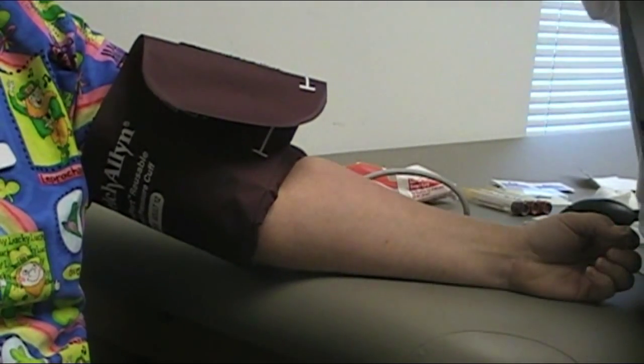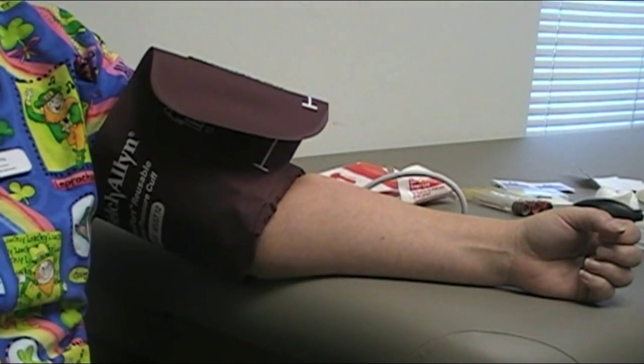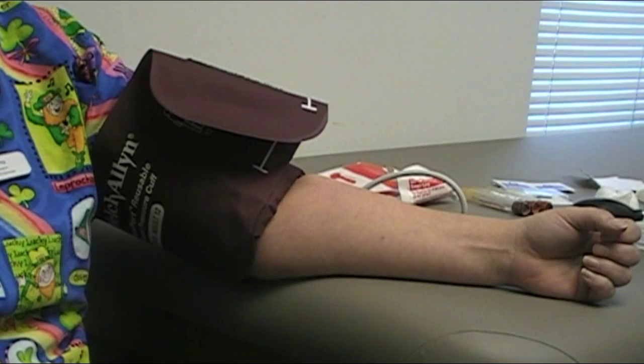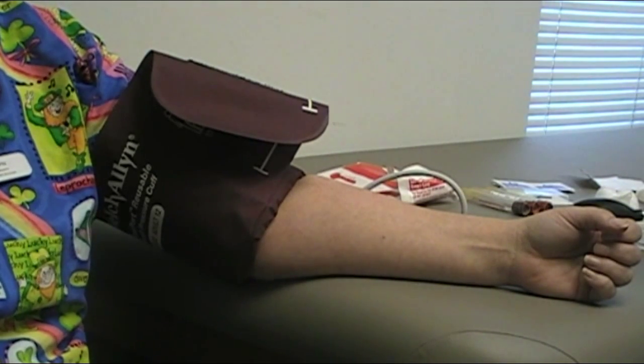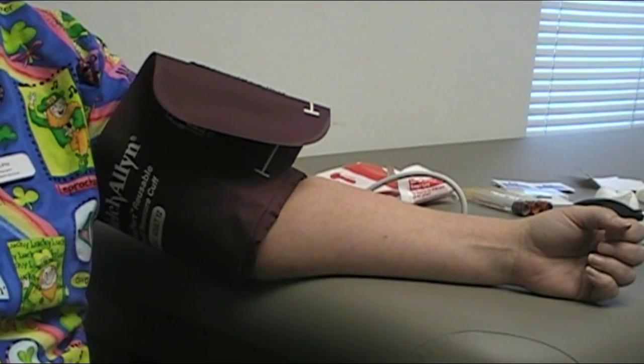Okay, for you. So the important part about the blood pressure now is that we're going to remember those numbers: 118 over 76. You're going to put your blood pressure cuff, when you're drawing the blood, between those two numbers — somewhere around 90, 95. The reason for that is for arterial flow in the limbs still, but not a bunch of venous return.